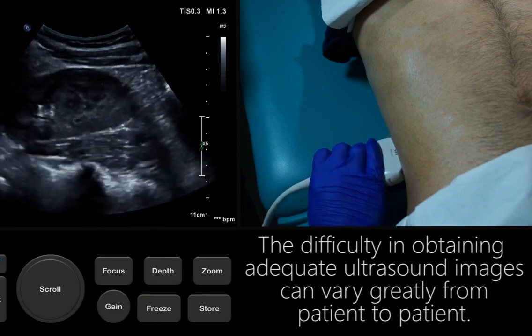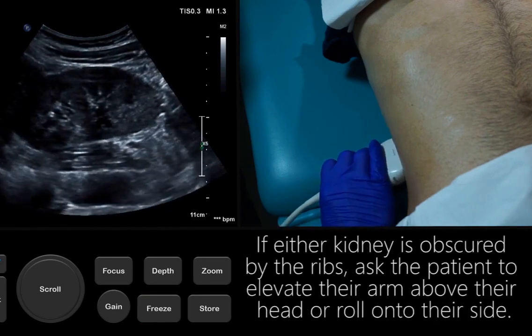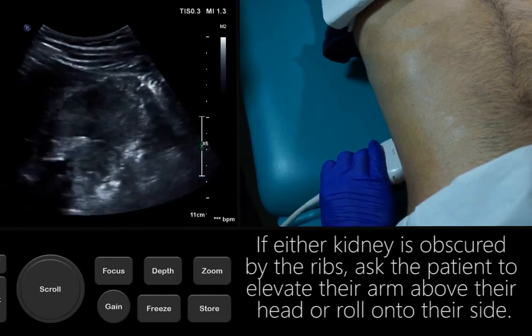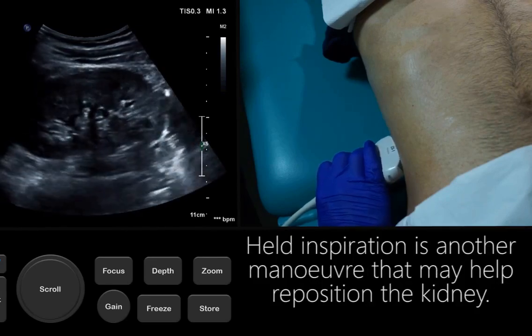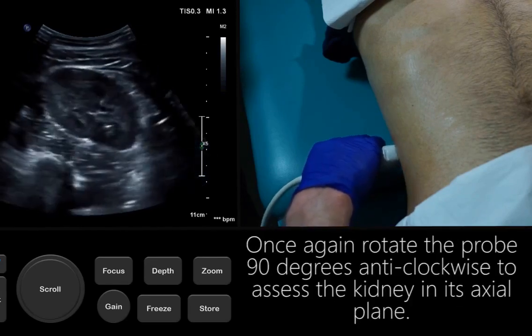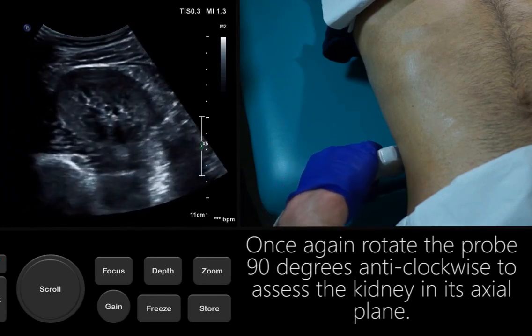The difficulty in obtaining adequate ultrasound images can vary greatly from patient to patient. If either kidney is obscured by the ribs, ask the patient to elevate their arm above their head or roll onto their side. Held inspiration is another maneuver that may help reposition the kidney. Once again, rotate the probe 90 degrees anti-clockwise to assess the kidney in its axial plane.